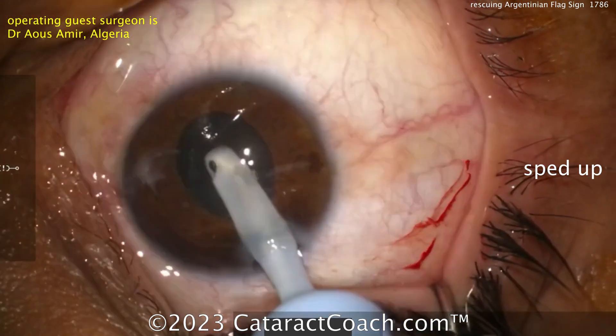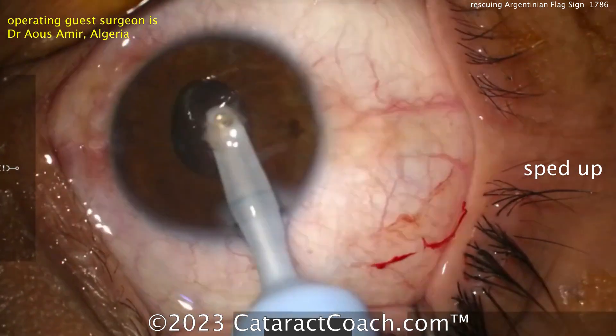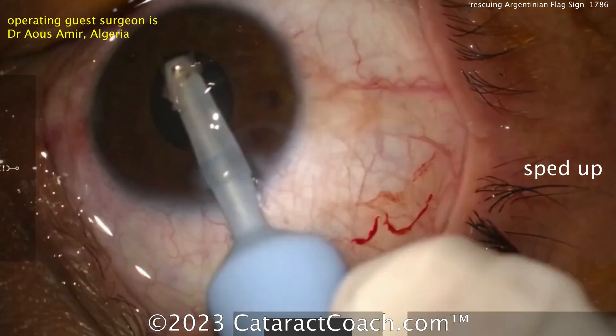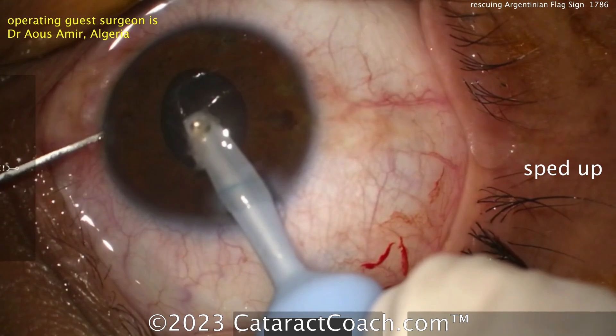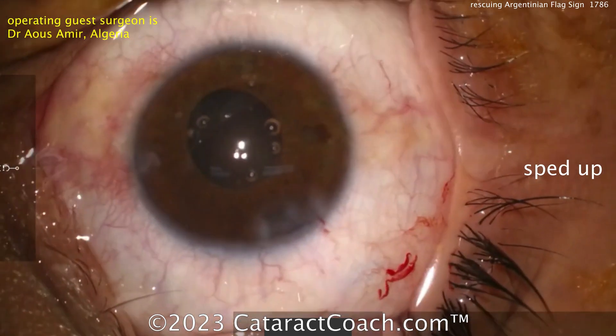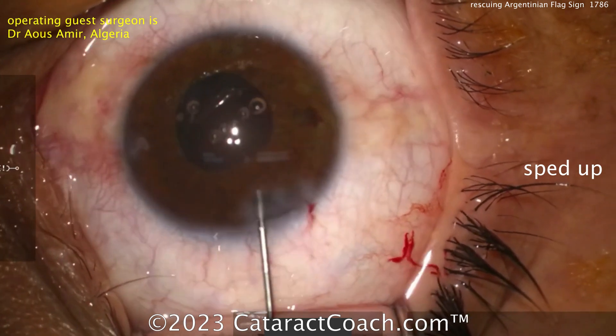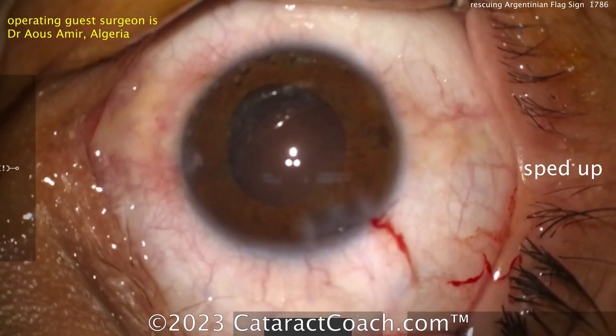A consequence of bringing the nucleus up and having the pupil hold it is that the pupil comes down a little — you get some miosis here. That's okay. Your second hand, your chopper, and your paracentesis can help you visualize things a little better. Maybe lift up the iris if you need to. Here's using a cannula just to push that last piece of material in, filling up the bag — that's a good bag fill.